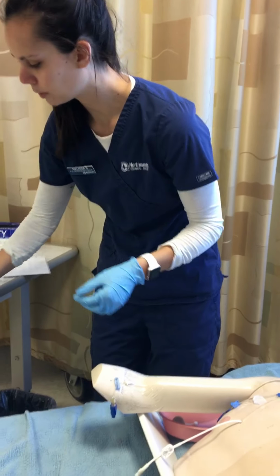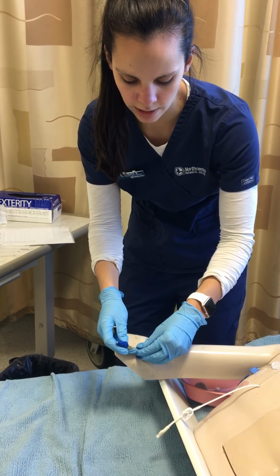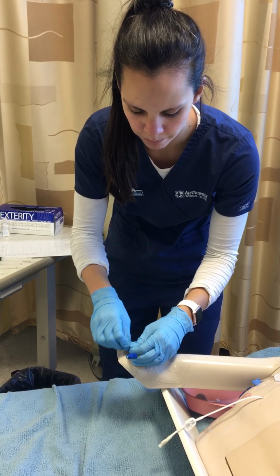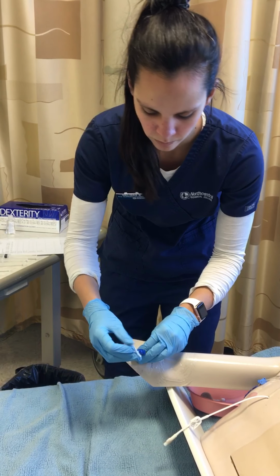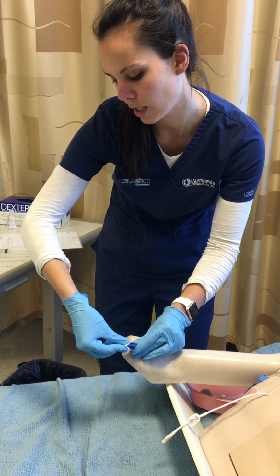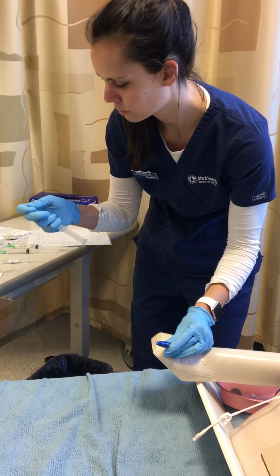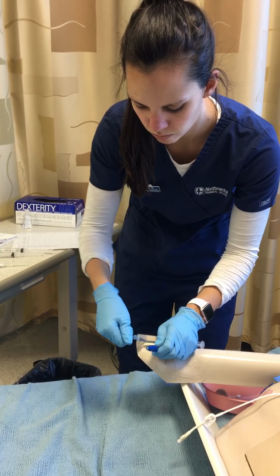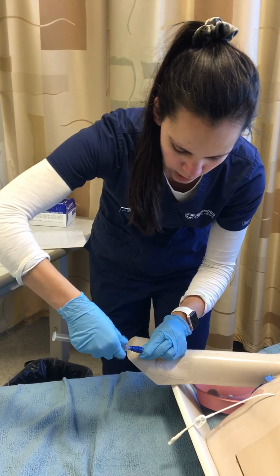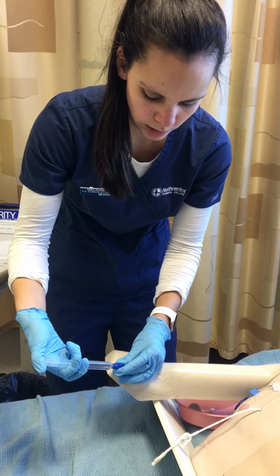Alright, so I'm going to clean my cap here with alcohol as my facility requires, for 15 to 30 seconds or however long the facility requires. And I'm going to flush the PICC line, unclamp it, flush my PICC line.